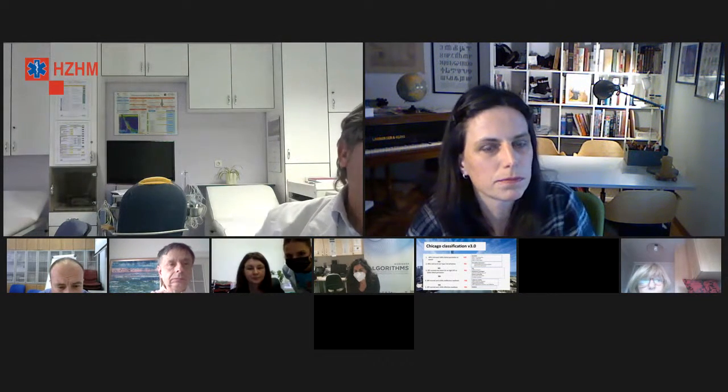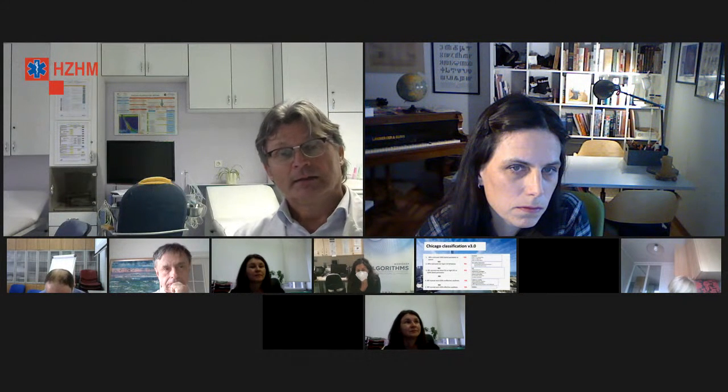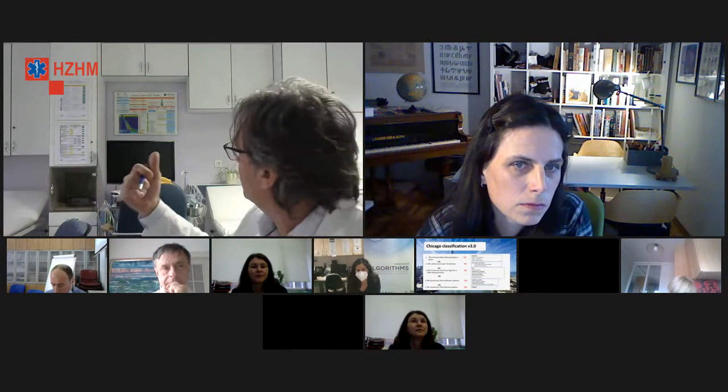Ruku na srce, high resolution manometrija je manometrija u lijepim bojicama, a ja se često vratim na linijsku kad hoću nešto podrobnije analizirati, i moram priznati da mi ona neke podatke pokaže bolje nego te cijele boje. Imamo ove postupnike, Chicago 1, 2, 3, London, ali ne smijemo glorificirati.